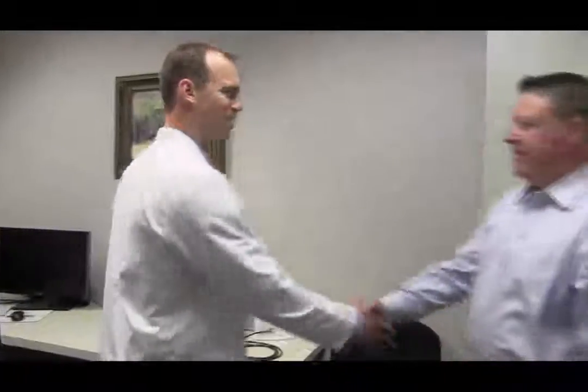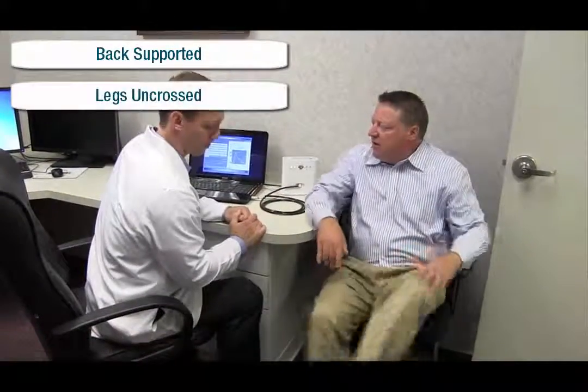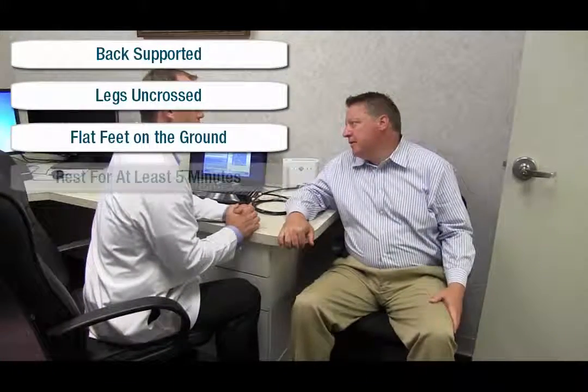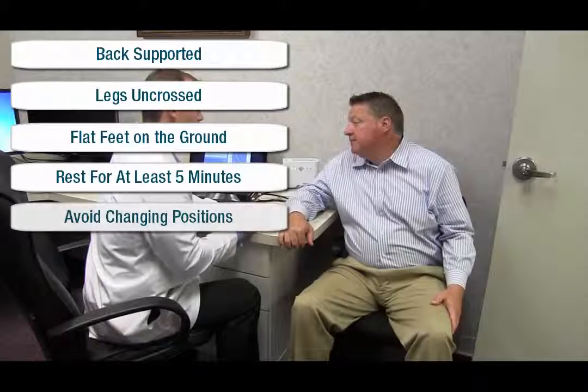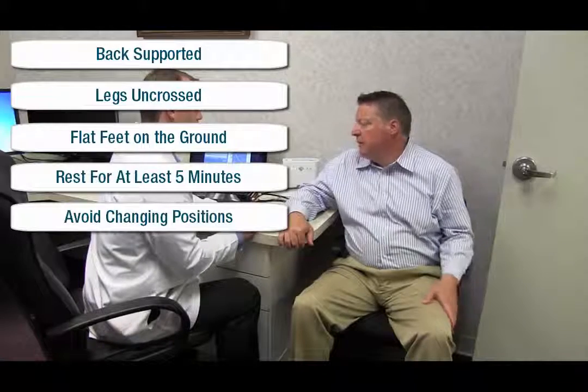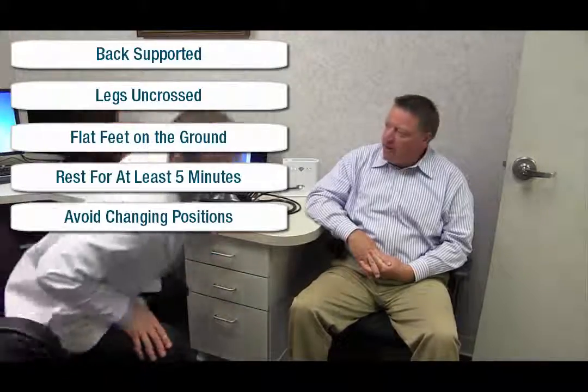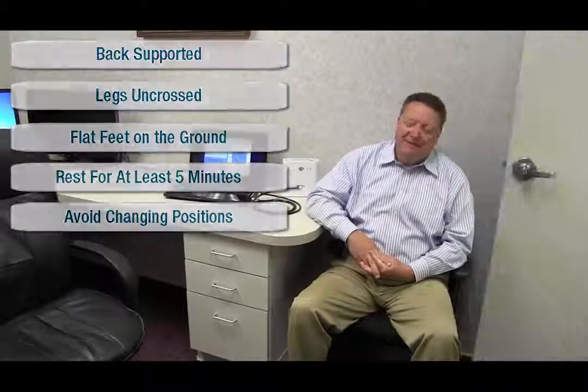To prepare for pulse wave analysis, follow proper protocol for brachial blood pressure measurement. Seat the patient in the chair so that his back is supported, making sure that his feet are not crossed and are on the ground. The patient should rest in this position for at least 5 minutes before the assessment begins and remain in this position throughout testing. If desired, the test may also be performed in the supine position.